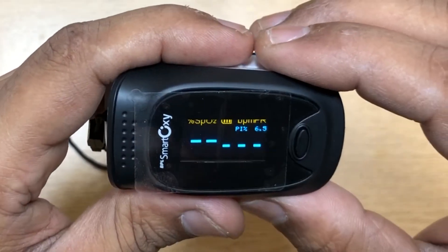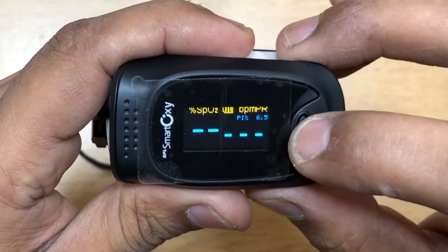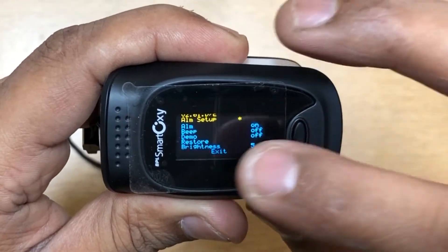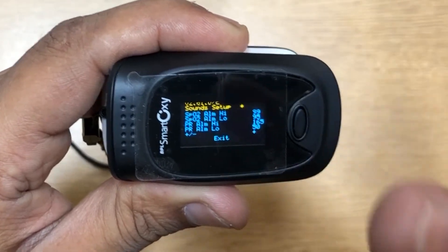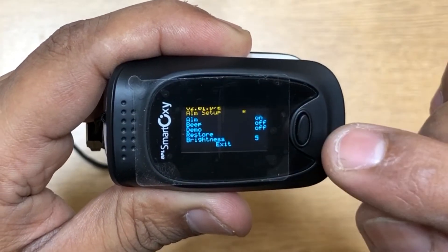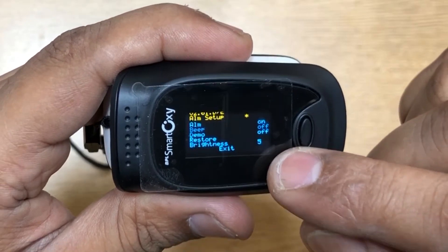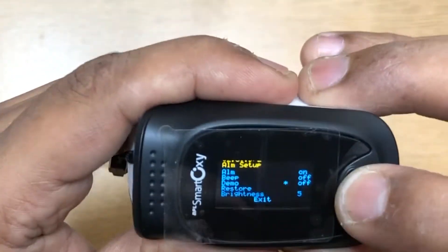Now let's take a look at the menu and how to navigate. To go into the menu you have to keep the single button pressed. You have two options: alarm setup and sound setup. In alarm setup you have the option of turning the alarm beep on and off, a demo option, restoring to default value, and a brightness setting.